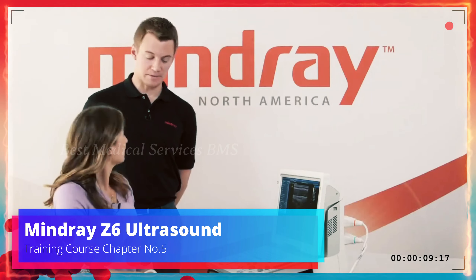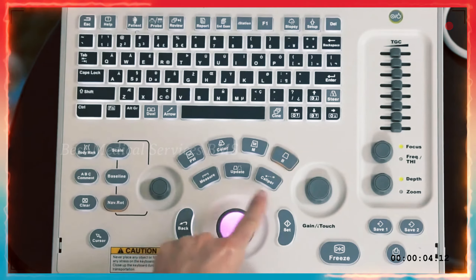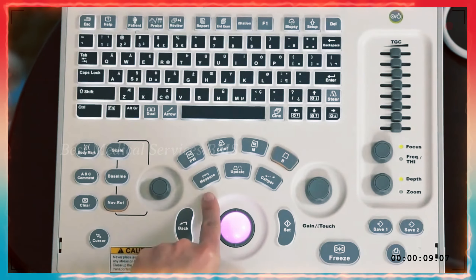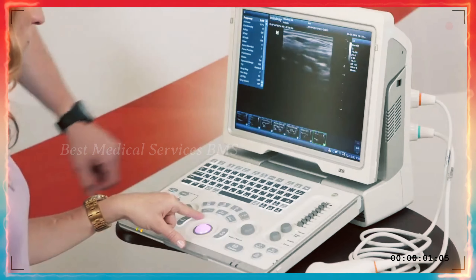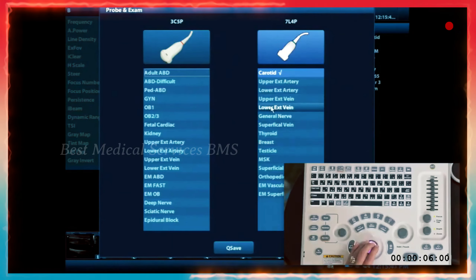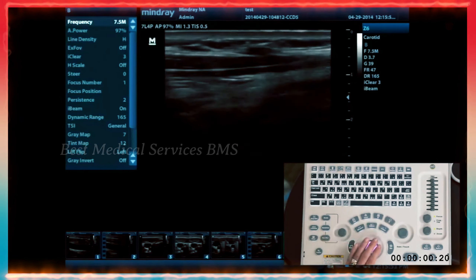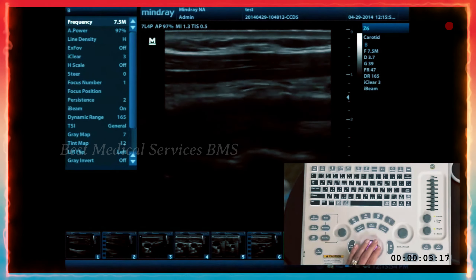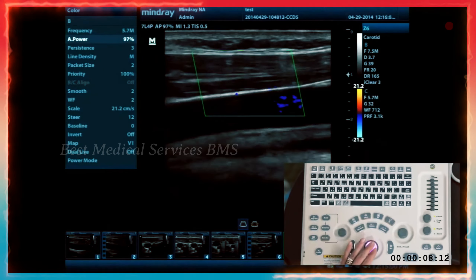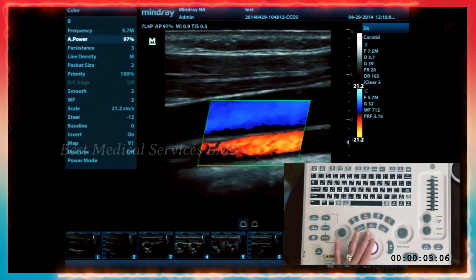In this section, we're going to talk about measuring. When you look at the keyboard, you'll see a measure option versus a caliper option. The measure option is very important depending on which exam preset you're in. Let's click back on the probe button and pick an exam preset such as Carotid. Now we're in the Carotid exam preset.